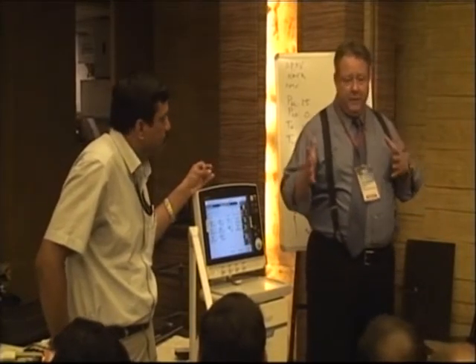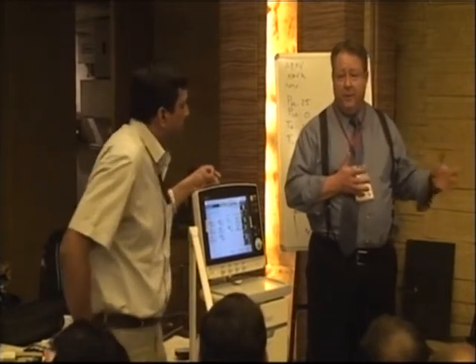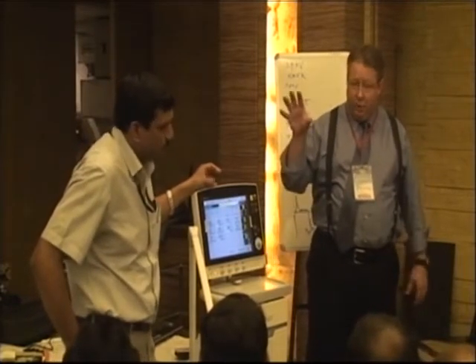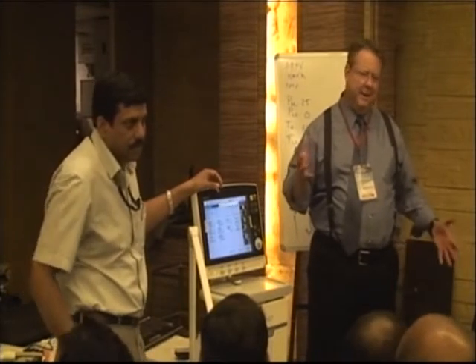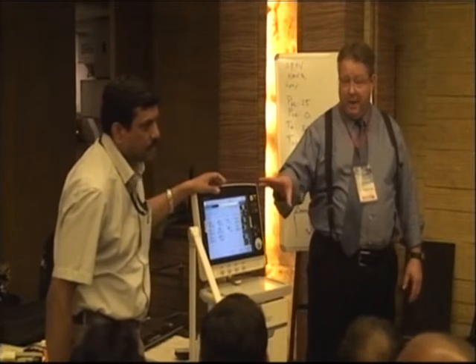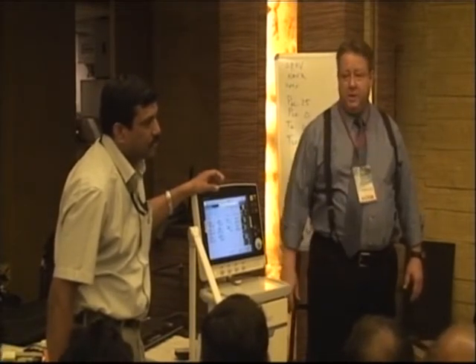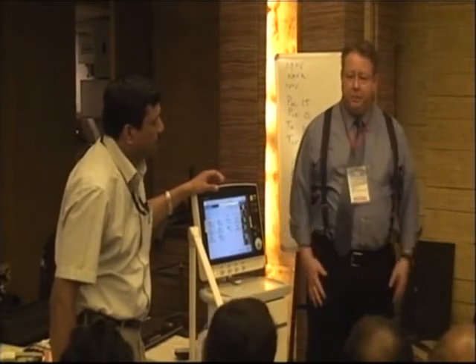Remember, our reason for extubating patients so slowly is usually because we have to let them wake up. We've sedated them and paralyzed them for a long time. This really changes how we approach the really sick patient who needs high ventilation, but to let them breathe spontaneously seems a little opposite to us. Yet the more experience we get with this, the better it's working, and we're never having to go to the oscillator for a lot of patients. We're able to do this instead: high mean airway pressures, but in a different mode.